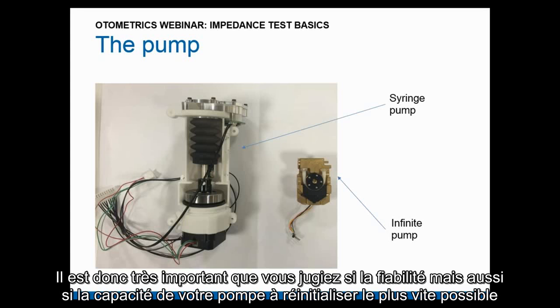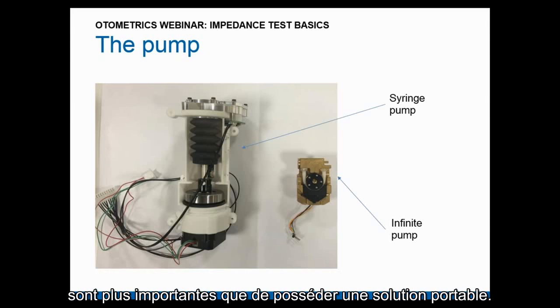So it's very important to consider the reliability, but also the capability for your pump to reset as fast as possible, compared to having a portable solution in your practice.